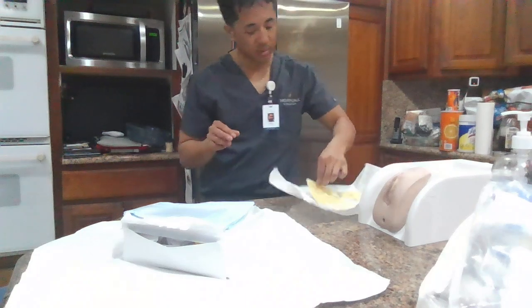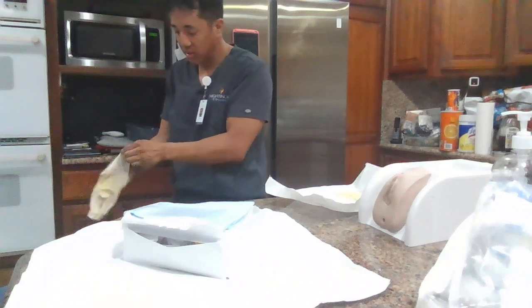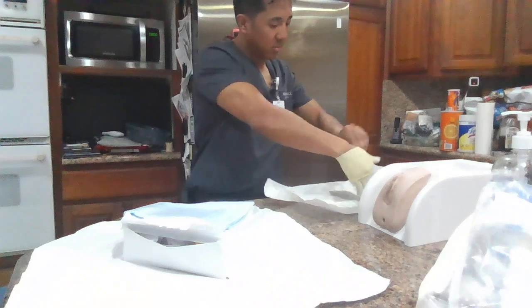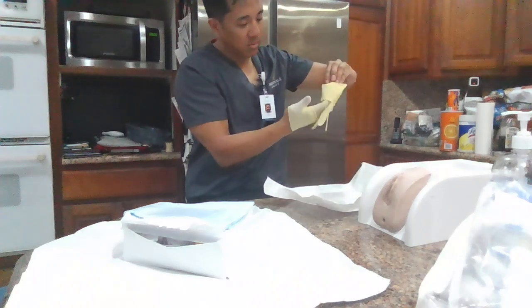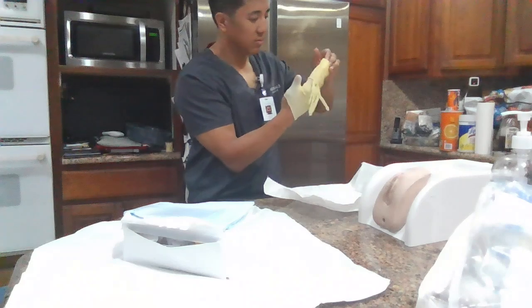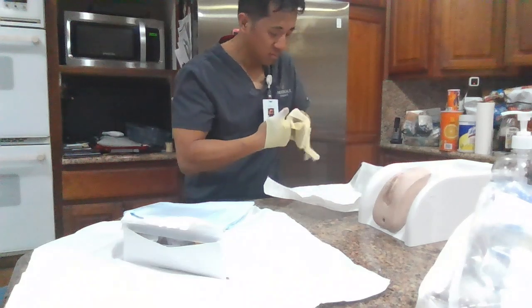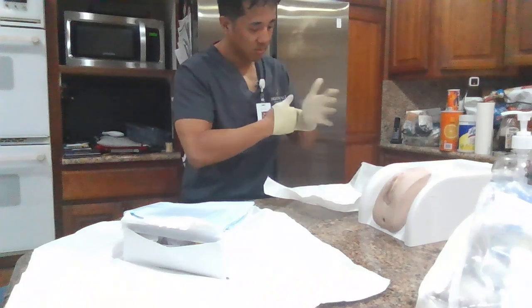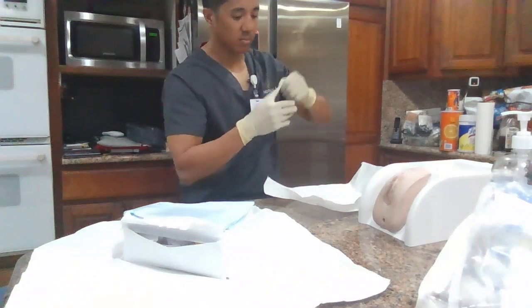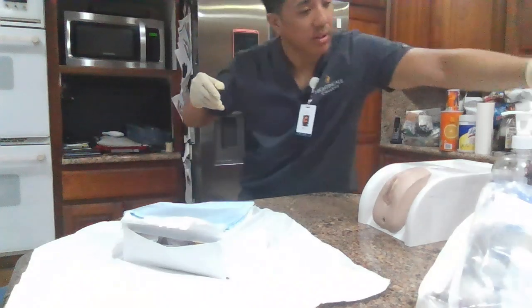Okay, I'm going to put my gloves on. Okay, I'm going to discard this out here.